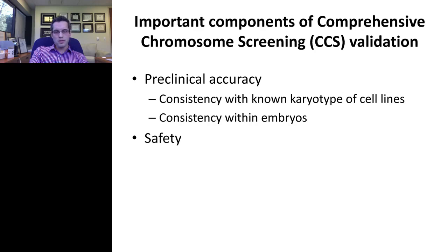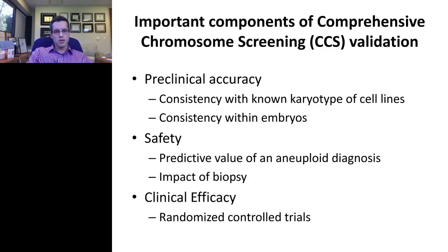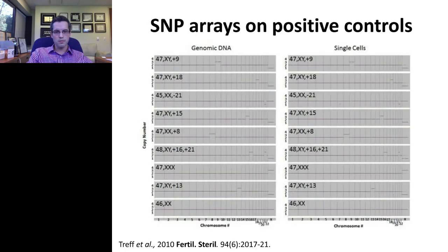We also wanted to investigate the safety of the procedure. One of the reasons why previous methods may not have worked well is because there may have actually been a risk of performing an embryo biopsy. So we looked at both the predictive value, which I'll talk about, the impact of biopsy to address the safety of the procedure, and then, of course, some randomized controlled trials to look at the clinical efficacy, again, before routine clinical implementation.